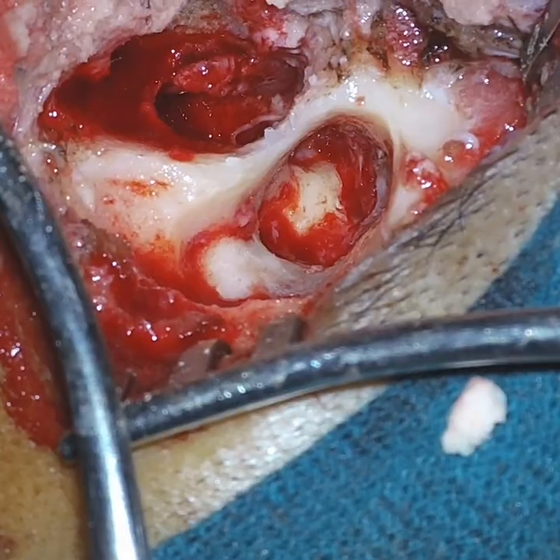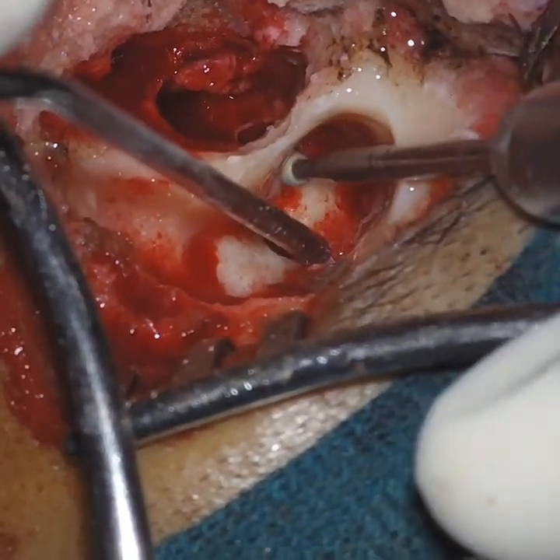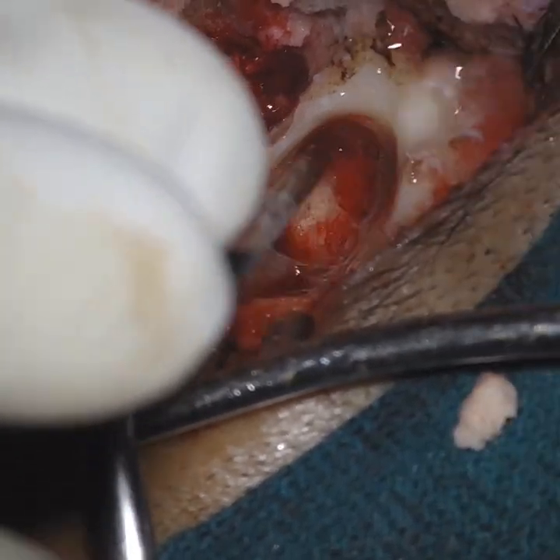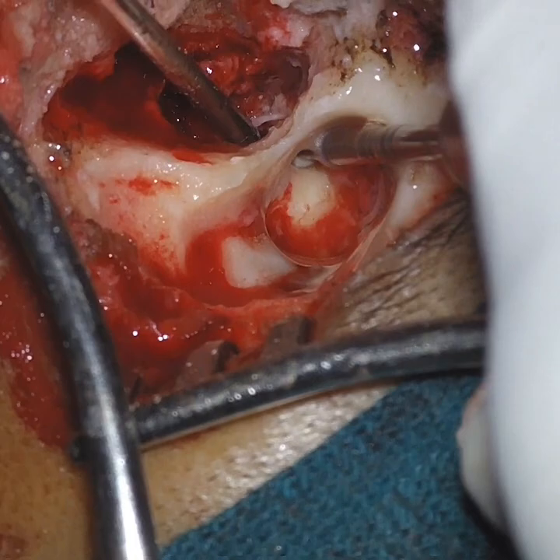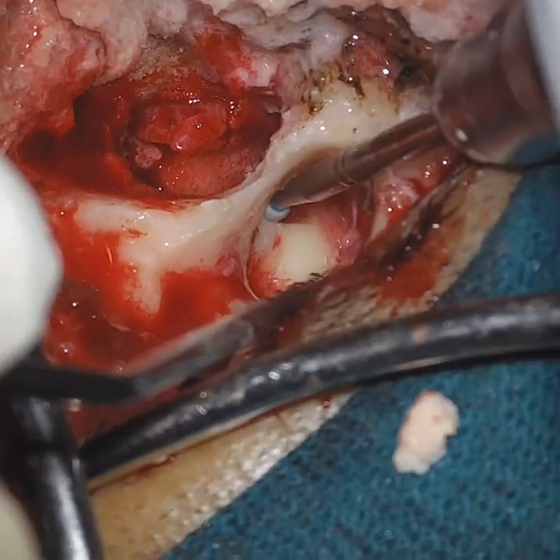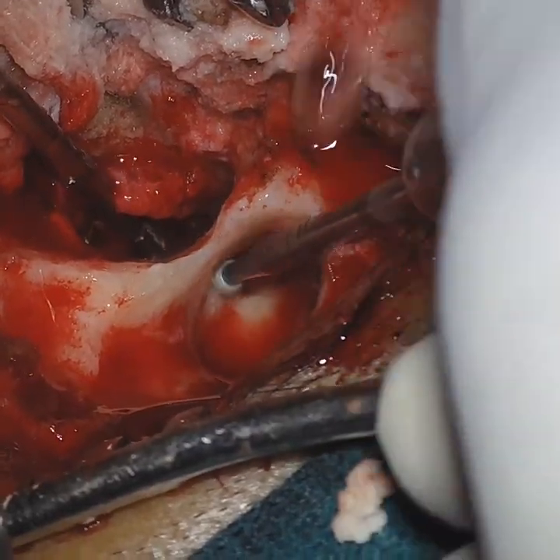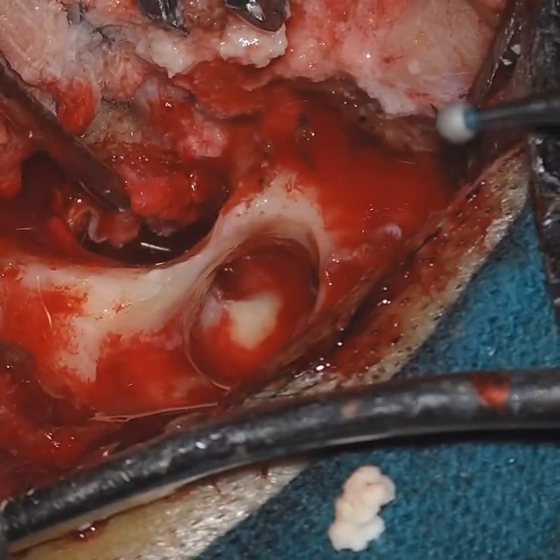As we do posterior tympanotomy regularly in cochlear implants, this technique of intact canal wall mastoidectomy is very important in preserving the canal wall, but it has a limited indication. I mean, it has an indication where maximum mucosa has to be preserved. So if you remove the majority of the mucosa, then this technique fails. So our aim is to preserve the maximum healthy aerating mucosa.